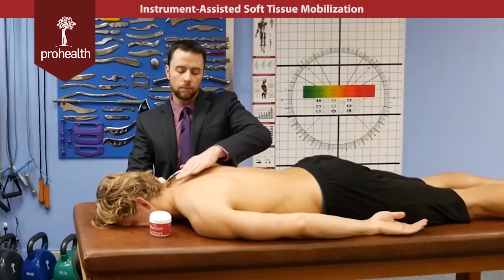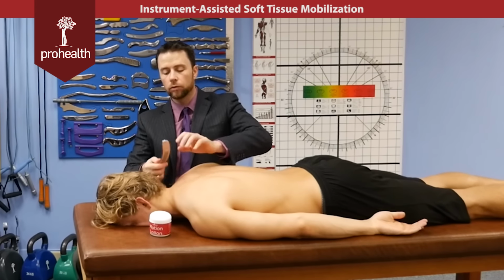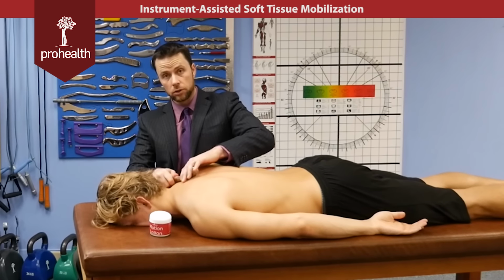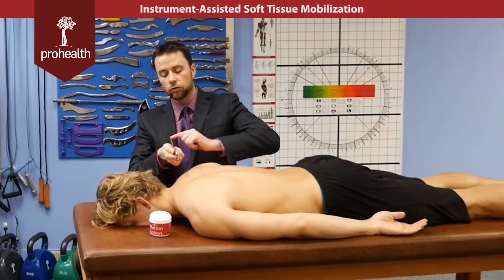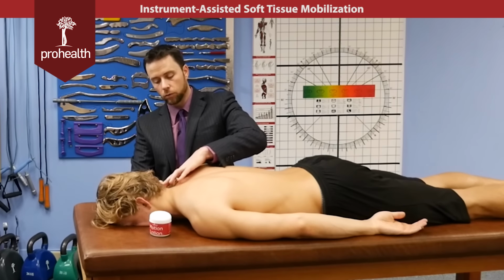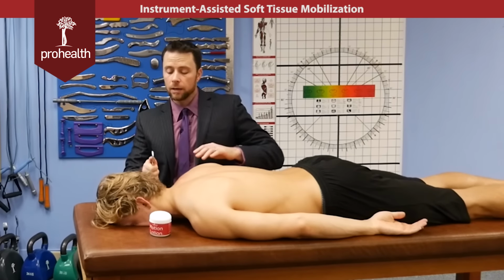So you start off nice and quick, find your area that you want to scan through and maybe spend a little bit more time. Simply flip the instrument over, go from concave to convex edge, and you can give a little bit more specific pressure over top of that region. If you wanted even more than that, you could flip the instrument around. This edge goes from dull to a little bit sharper in this area, and you could start to dig in and get a very specific contact working on those knots or adhesions that you might find in that area as well. Okay?